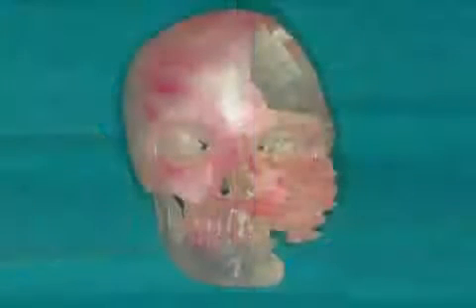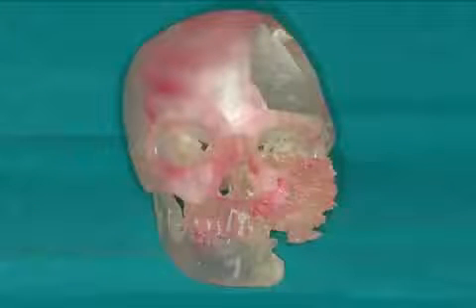After about 6 months, a CT check is performed, and if the bone has formed well, an implant is placed. The patient then receives artificial teeth again. By means of these models, surgeries that were impossible only a short while ago can now be performed.